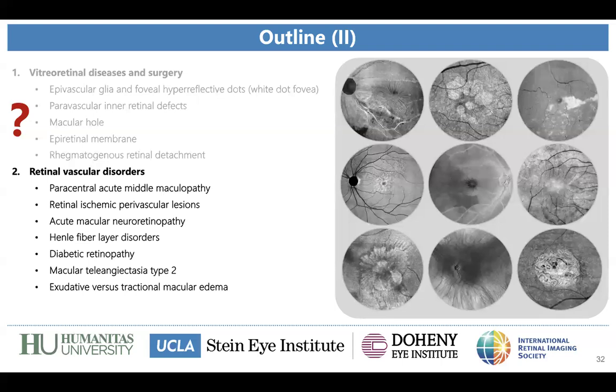And as I showed you also in the context of epiretinal membrane, where we can distinguish foveal versus extrafoveal patterns, yeah.